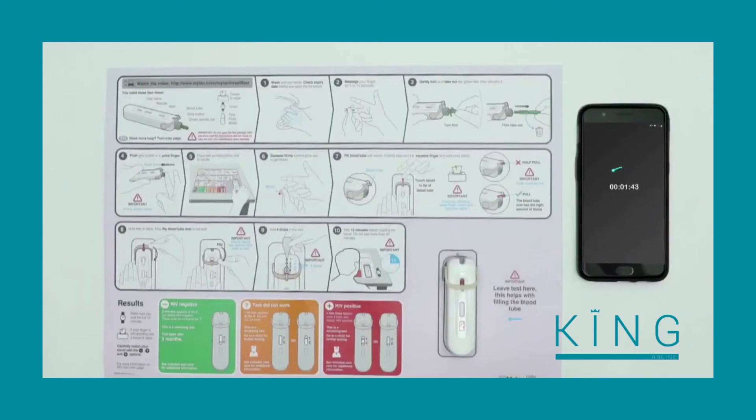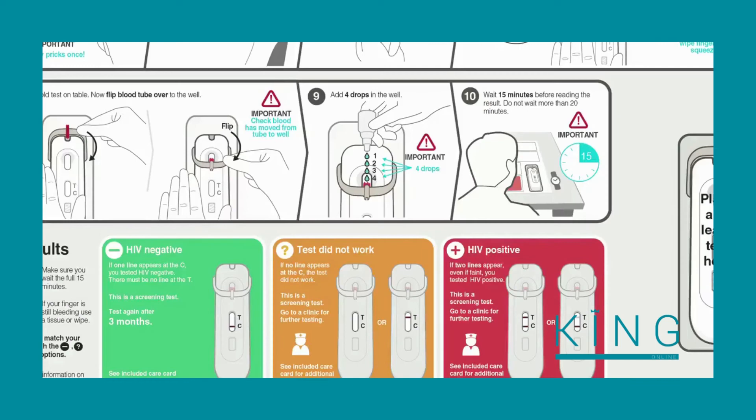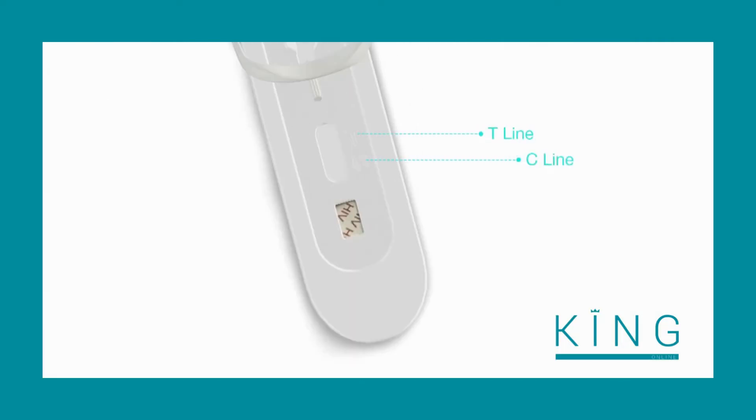Set your timer and wait fifteen minutes before reading the result. Reading the result before fifteen minutes could give you a false result. However, do not wait longer than twenty minutes. Match the lines in the results area of the test with the colored boxes on the instructions — it is the lines next to the C and the T which tell you your results.